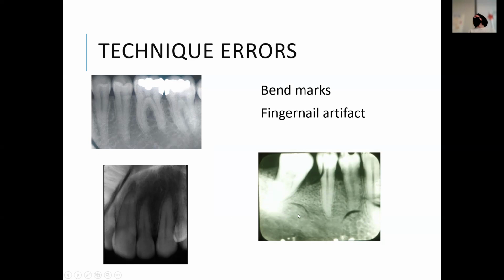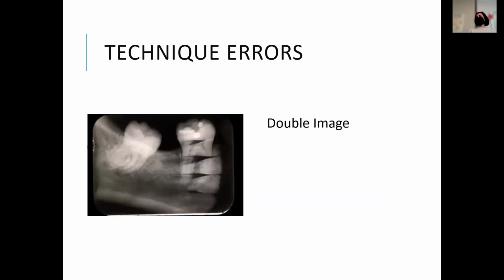And then this is like fingernails. When somebody was handling it, they maybe had long nails and were just poking at the film. I don't know quite how you would get that many fingernail marks on a film, but somebody did. So pushing or scratching at it will affect the end result.